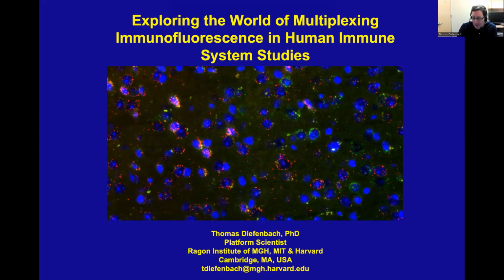With that, I'll talk about the technology. In the past, there have been approaches like multispectral imaging and just the process of multiplexing itself. But those traditionally have been limited in terms of throughput, because usually you take a single field of view at a time, and you might do some multispectral imaging on that and do some unmixing. And that can be very time consuming. What we require is to be able to see globally the entire tissue and to be able to see where cells are going in, for example, lymph nodes, and profile them in terms of their activity during infection.